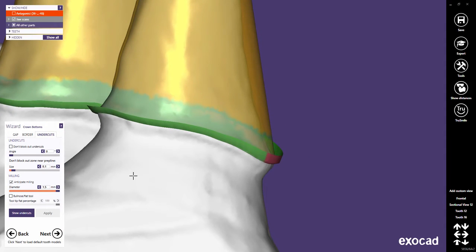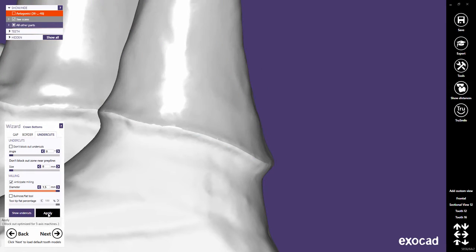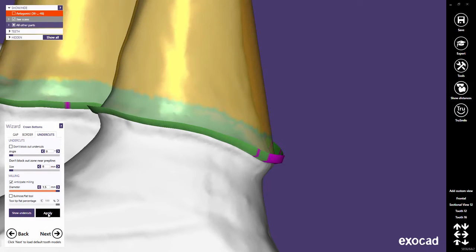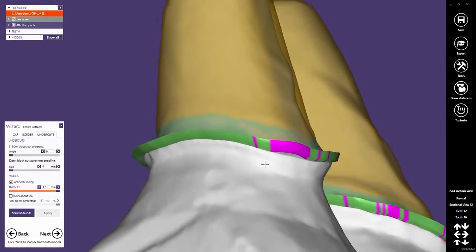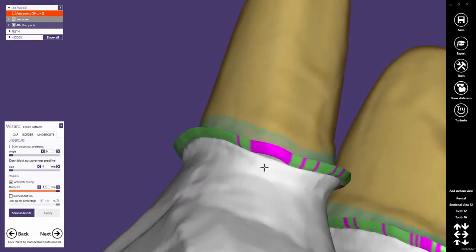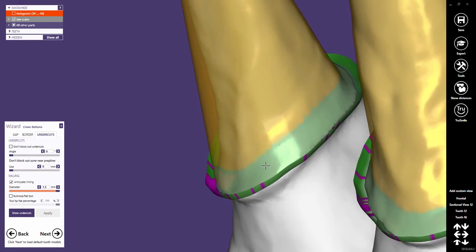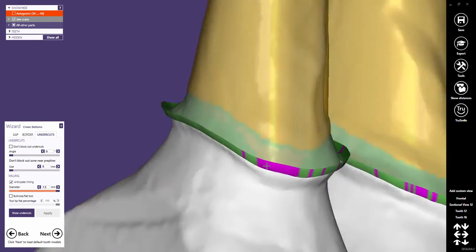Now I will demonstrate the behavior with Don't block out zone near prepline set to 0, a setting commonly used in 3-axis mode. As you can see, the crown will not be in contact with the preparation along the margin. These gaps are marked in magenta.